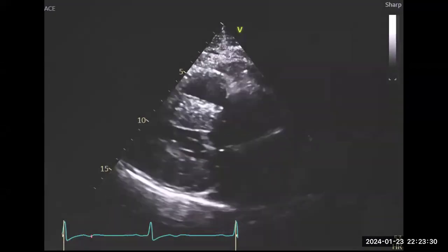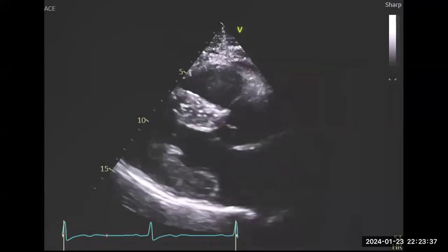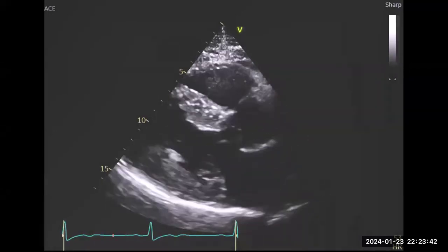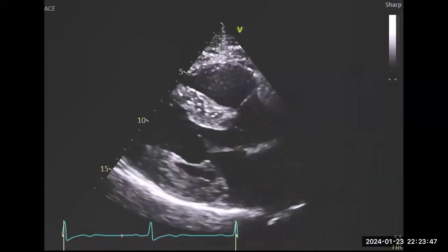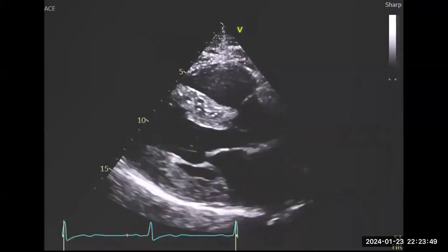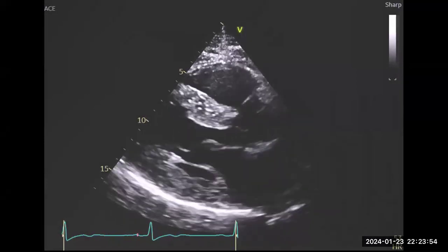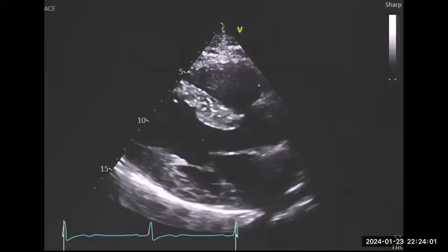This patient came to me yesterday in the clinic, so luckily I brought the image immediately. There are multiple views, but I need a single comment about this. What do you see here? Severe LVH. Okay, severe LVH. What else? Symmetrical. Okay, concentric or symmetrical. Possibility of SAM, but we need M-mode.